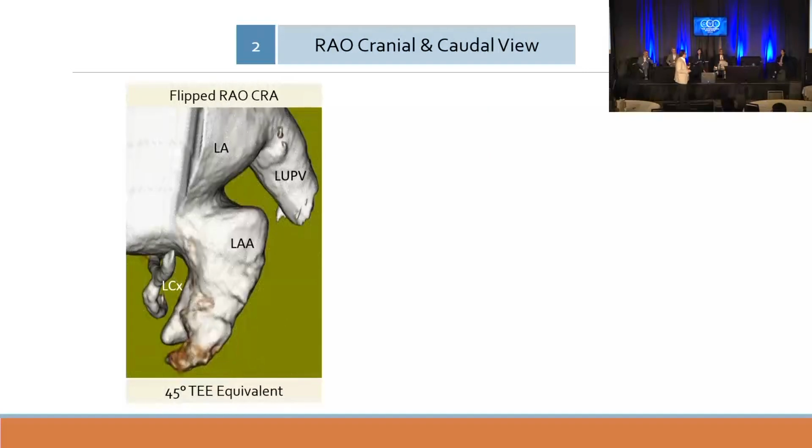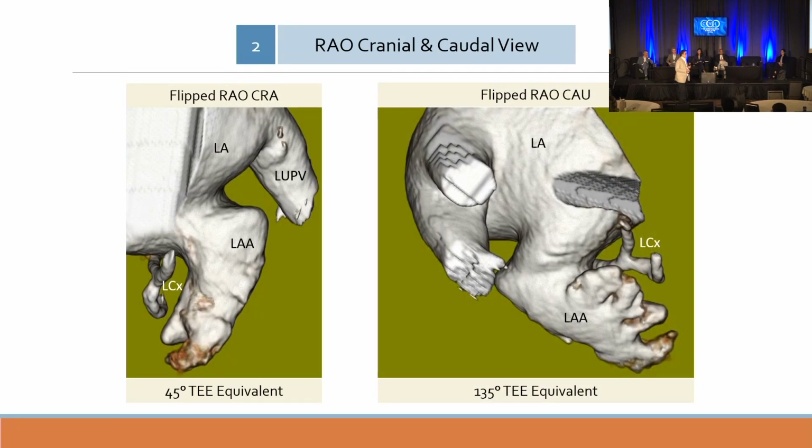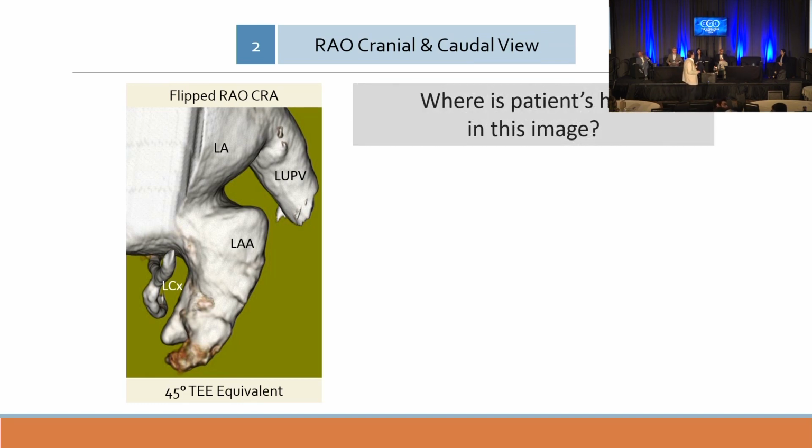But if you're an echocardiographer, maybe these images would be more likely to show you how you typically see. This will be a 3D rendering of CT to look like TEE images.